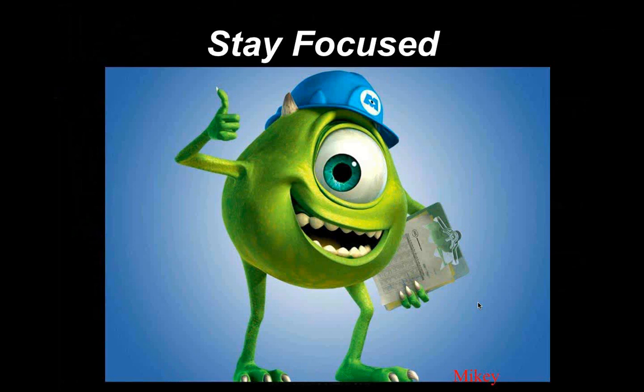As far as diameter is concerned, one will acquire a feel for that's a big cornea. Now you can measure the corneal diameters. That's pretty scientific, actually more scientific than I use on these. I just kind of eyeball it, sorry for the pun, and say, okay, that's a normal. Normal's about 11.8 millimeters, and am I going to want to go big?